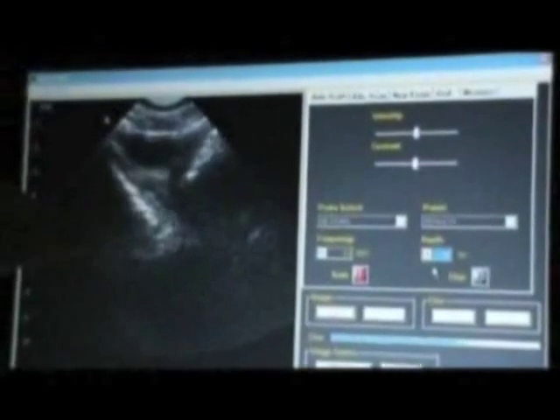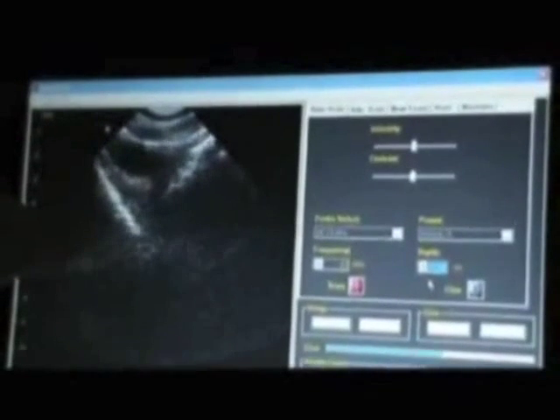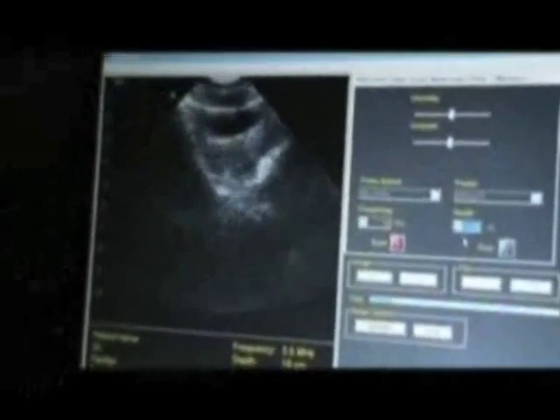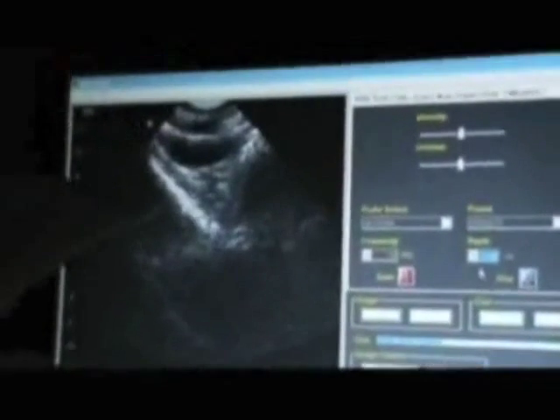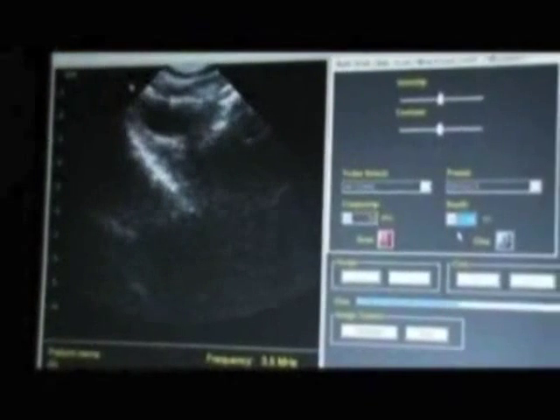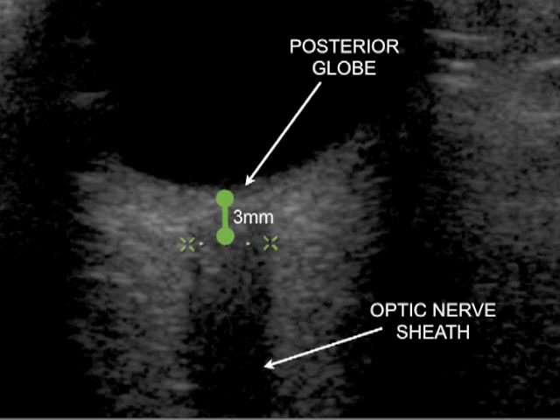So we look for the optic nerve, which is, let's move the probe around. So this is the back of the retina here, scanning backwards and forwards across his eye. Really looking at the back of this retina, trying to find the optic nerve. It's there. Black line.